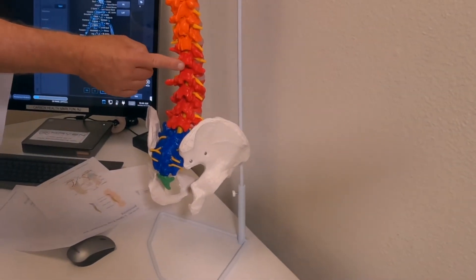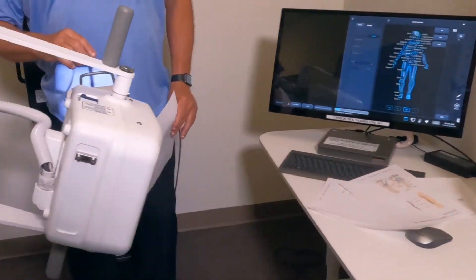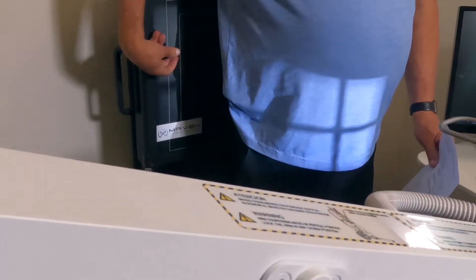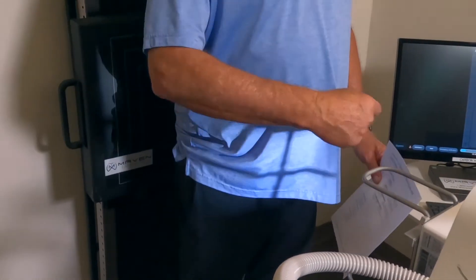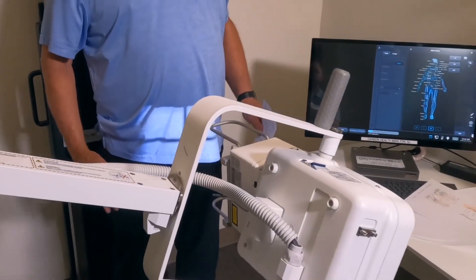This would be L1, L2, and L3. The DR panel should be aligned with my L3 vertebrae.